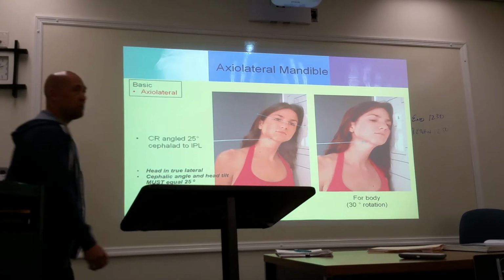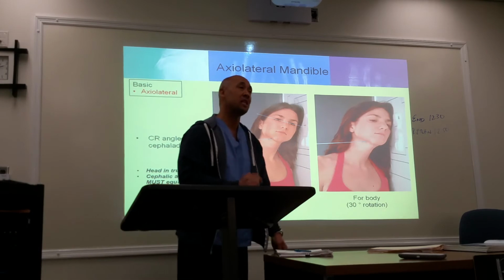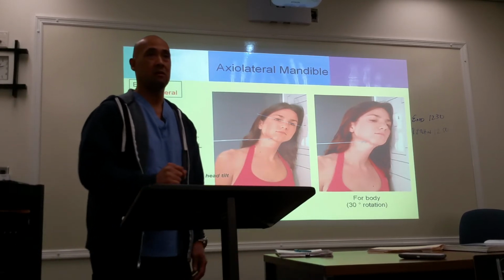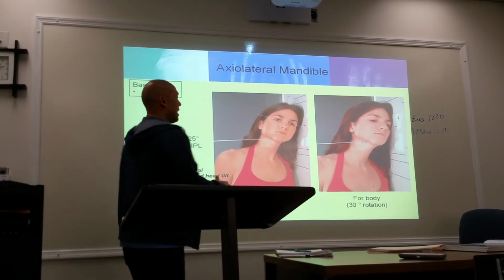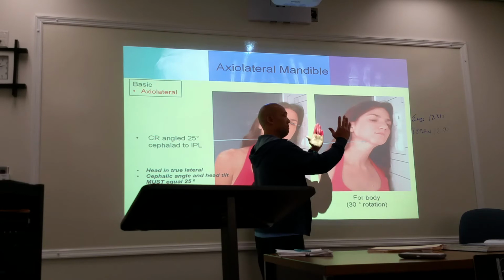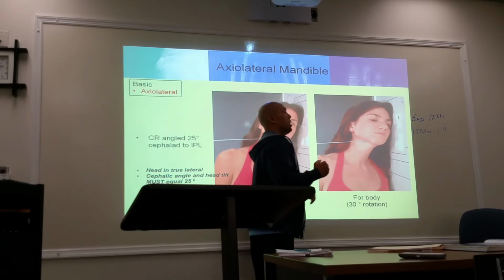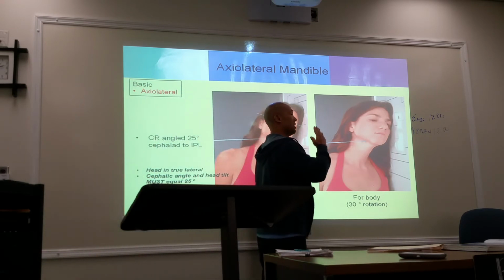All right, so to accomplish this, the magic number here is 25 degrees. The magic number is 25 degrees. This 25 degrees can be accomplished in several ways. If you place the patient in a true lateral position, okay, you guys paying attention? True lateral position. Your angle is going to be 25 degrees cephalad.